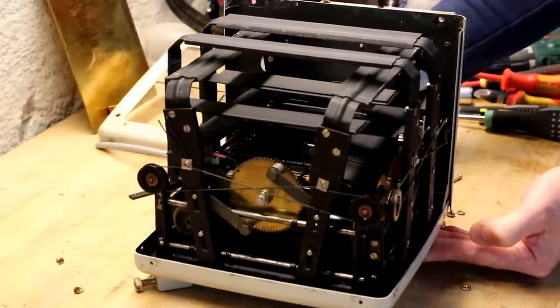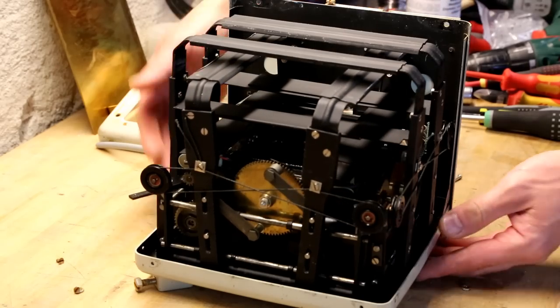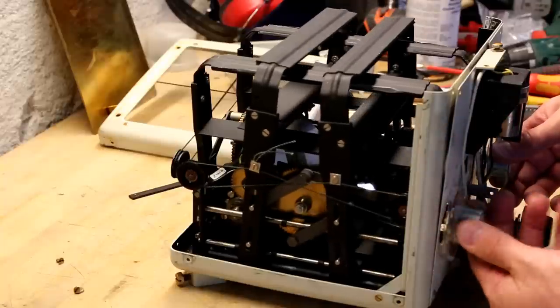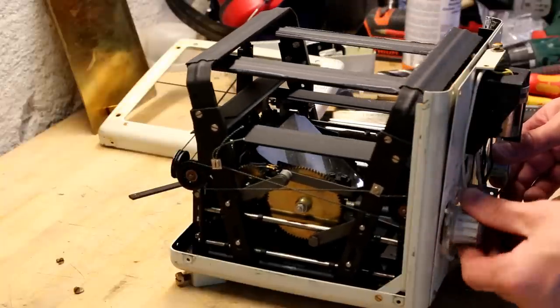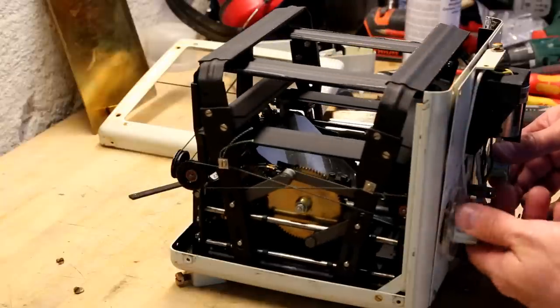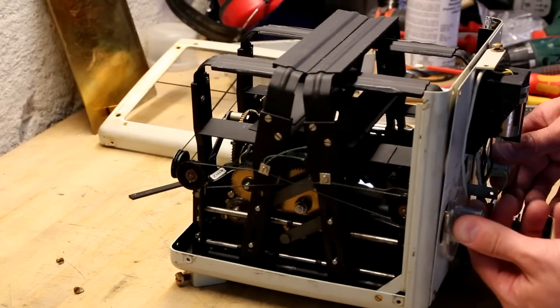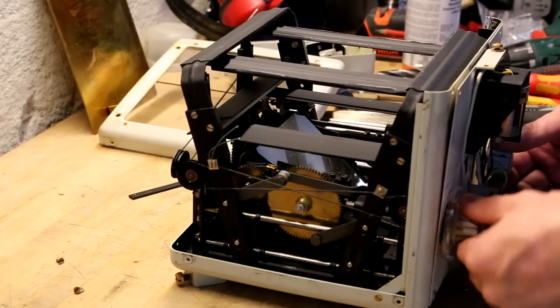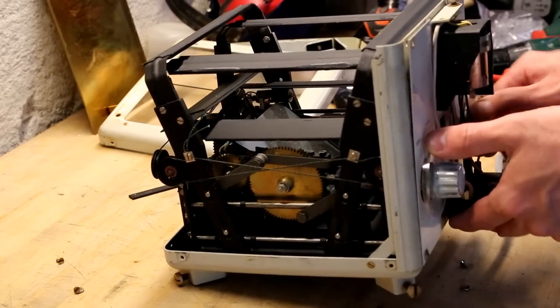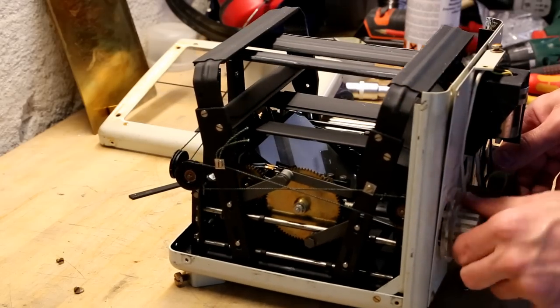Those two springy parts that we saw underneath, they move along with this as well. Let's just turn it another turn, so you can see the gear action from the side here. Very elaborate gear work here with shafts and a bar gear, arms, cylinders, string pull, very very nice. This is, however, a little heavy to turn.